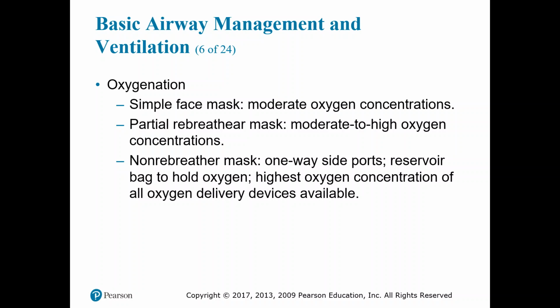The flow rates generally range from 6 to 10 liters per minute, and they provide 40 to 60% oxygen at the maximum rate, depending on your patient's respiratory rate and depth, of course. Delivery volumes beyond 10 liters do not enhance the oxygen concentration, because once you exhaust the oxygen that's in the mask, you're pulling in room air. So it's really not delivering any higher concentration if you go up to 15 liters, other than making more noise.